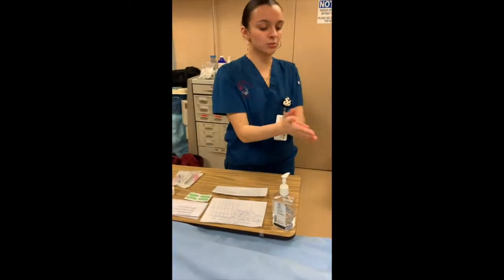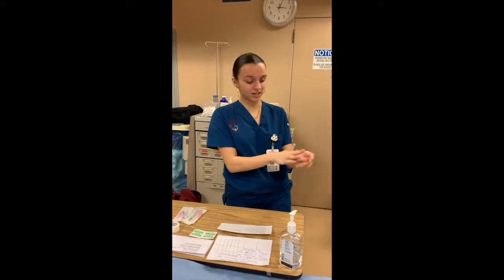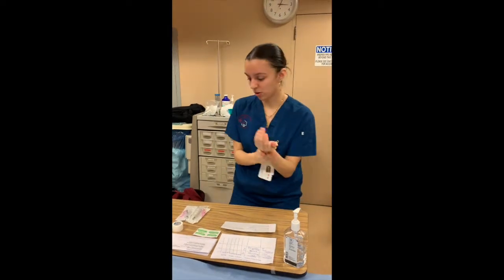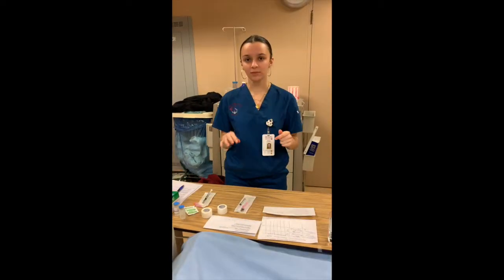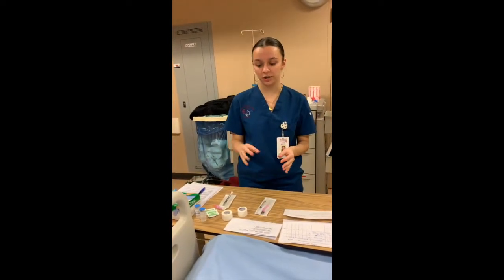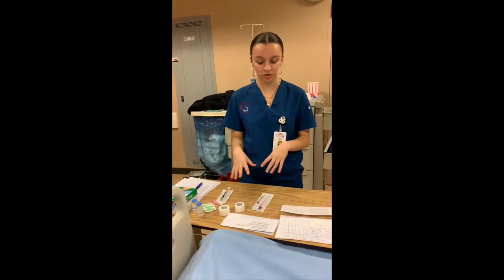We need to perform hand hygiene. So in this case, we're just going to do a quick hand rub with the sanitizer and the alcohol rub, making sure we are all ready and hand hygiene is performed. Okay, so now we can actually start prepping the syringes and the needles for the subcutaneous and the intramuscular injections.